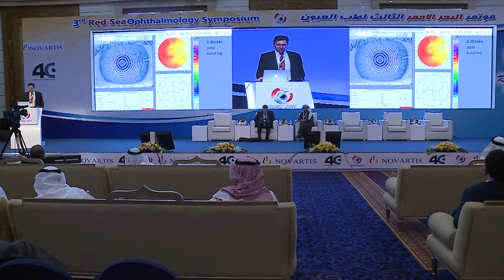Right. So the next step then was, I told this patient, because of the irregularity, I'm going to do this in 2 stages. And the first step is going to be the regularization. We'll wait for 6 months, and the second part will then be just the refractive correction. So we decided in these cases, especially if the patient knows it's 2 stages, it lends itself to doing the topography-guided treatment as a trans-epi procedure.